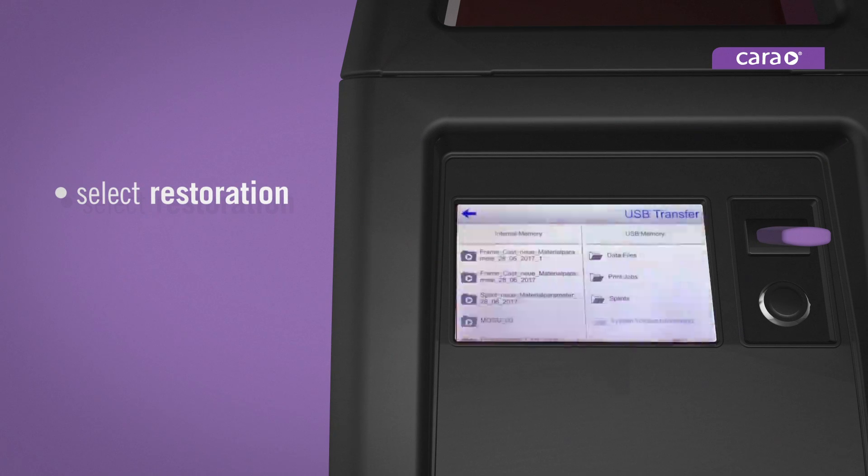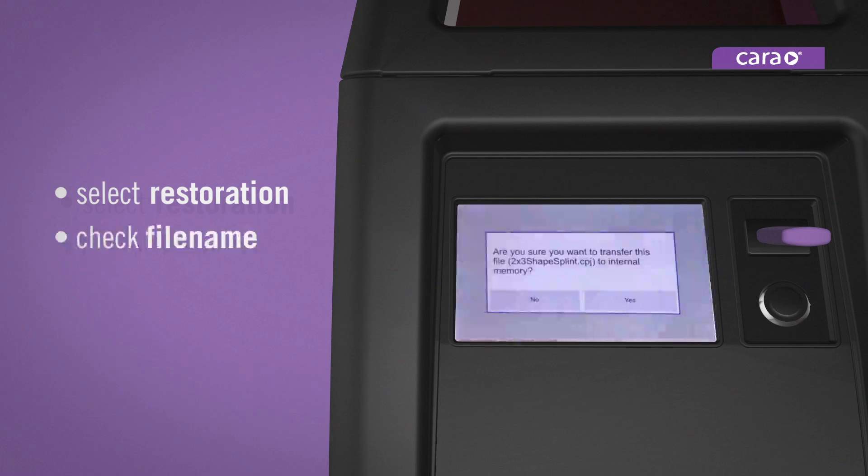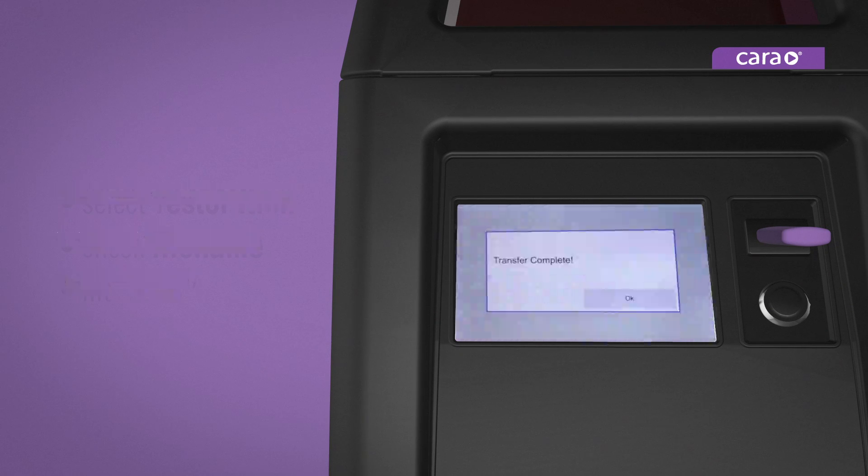Select the restoration you wish to print on the right side of the screen under USB memory. When a pop-up window appears, check that the file name is correct and hit yes to confirm. The file is automatically checked to ensure it is a valid print file. When the transfer complete window appears, hit ok.